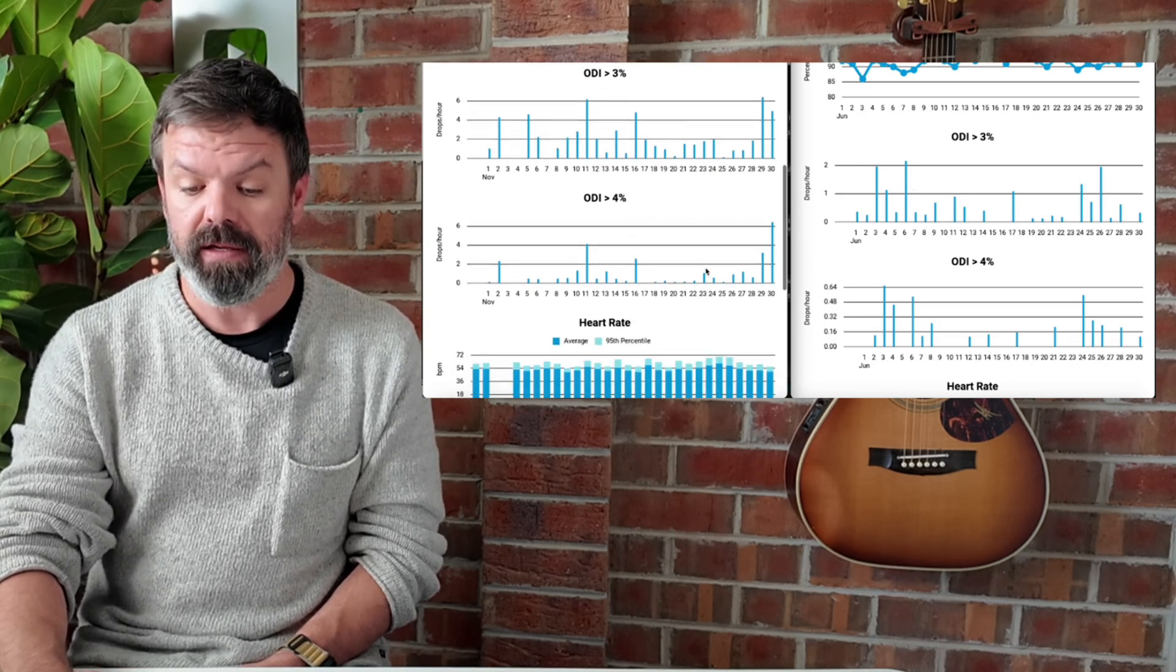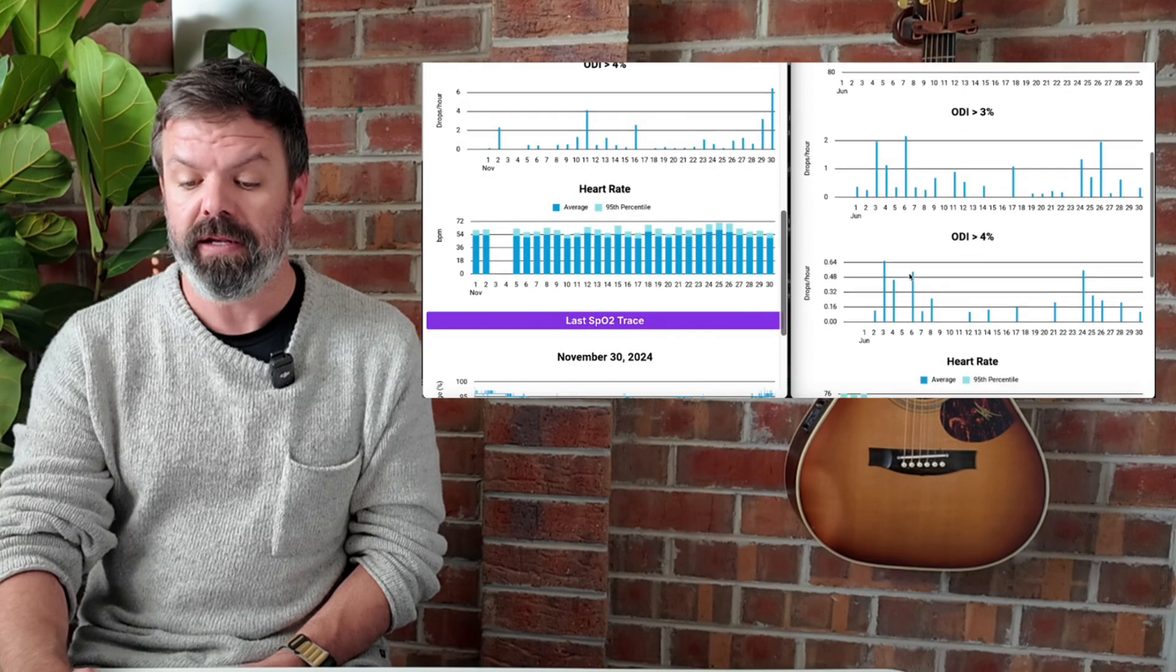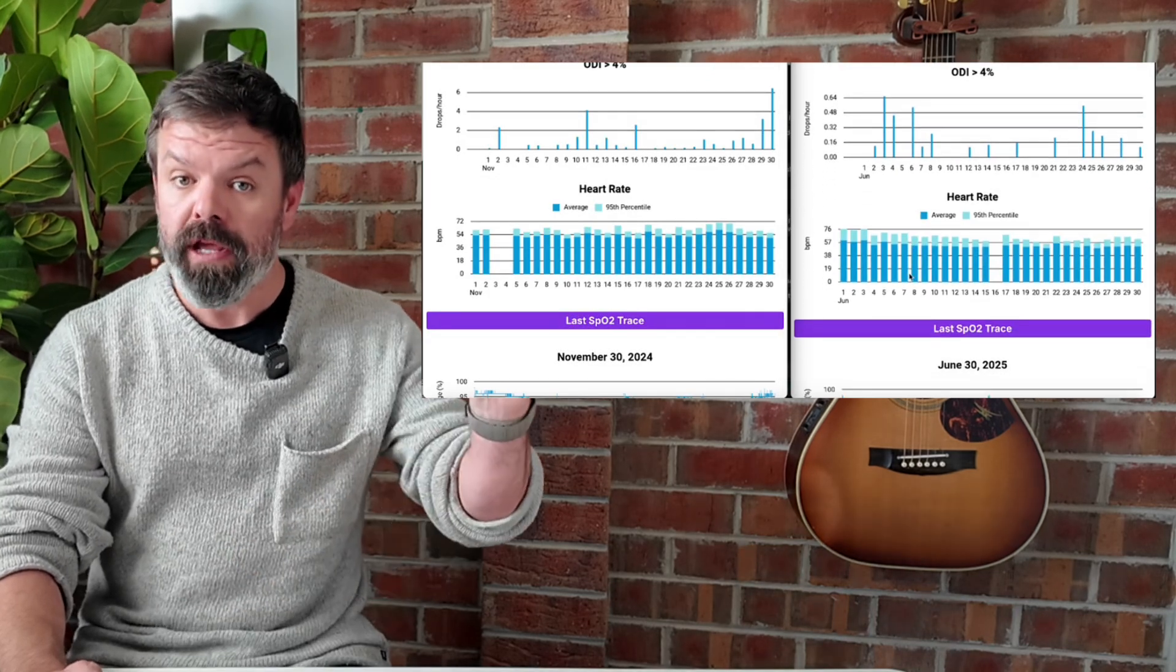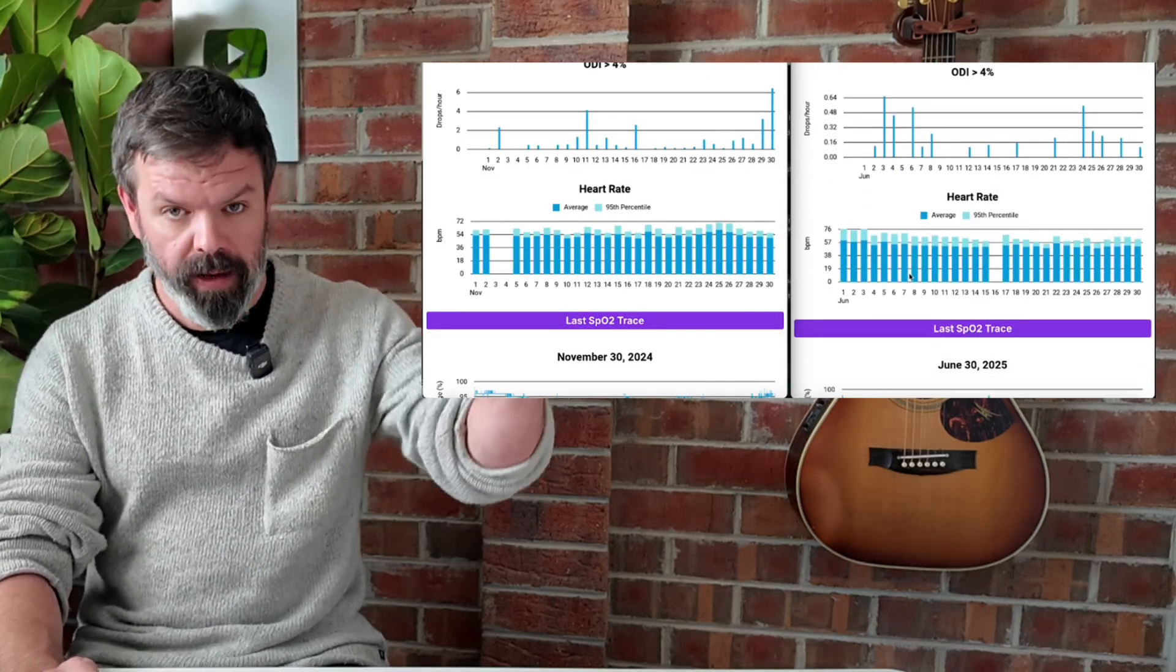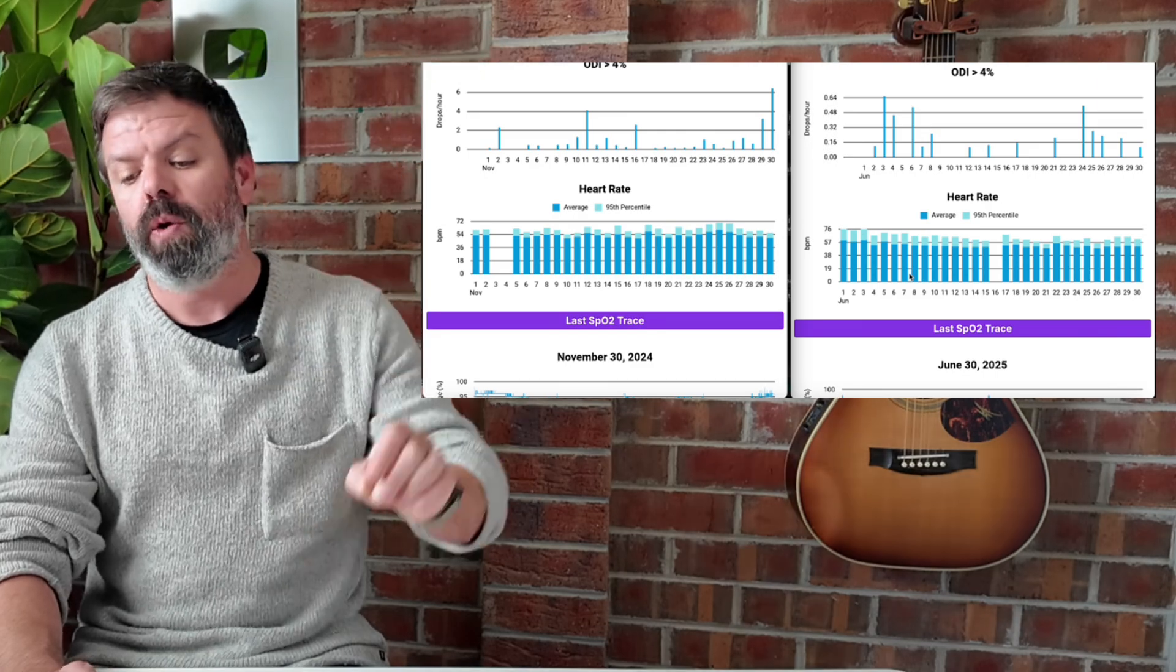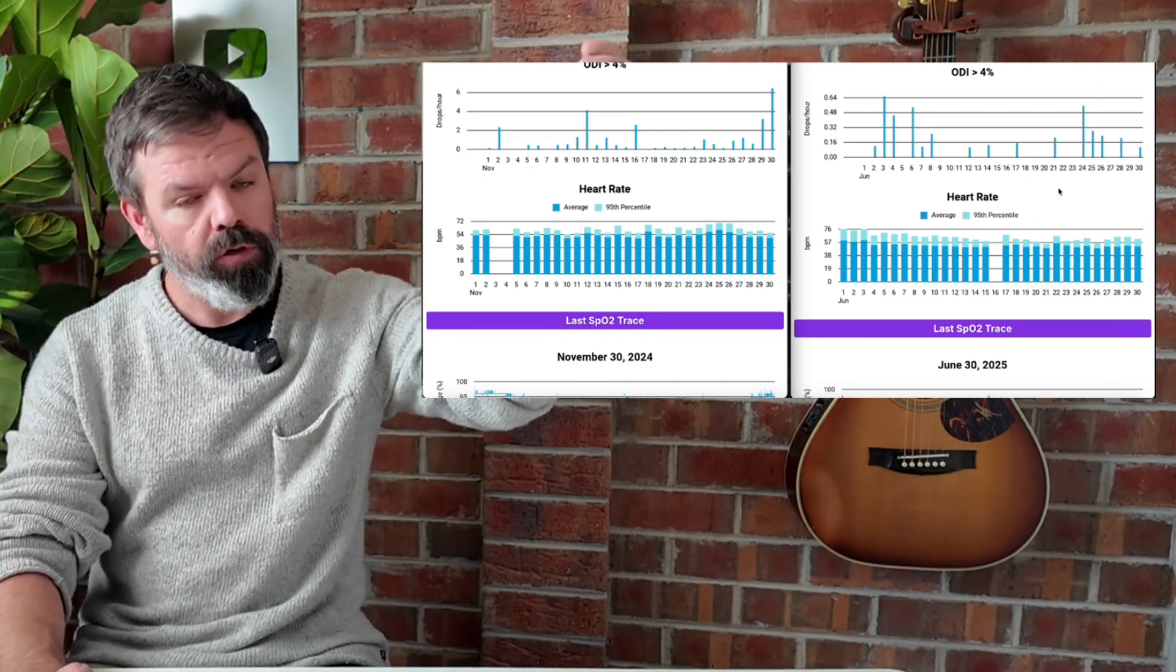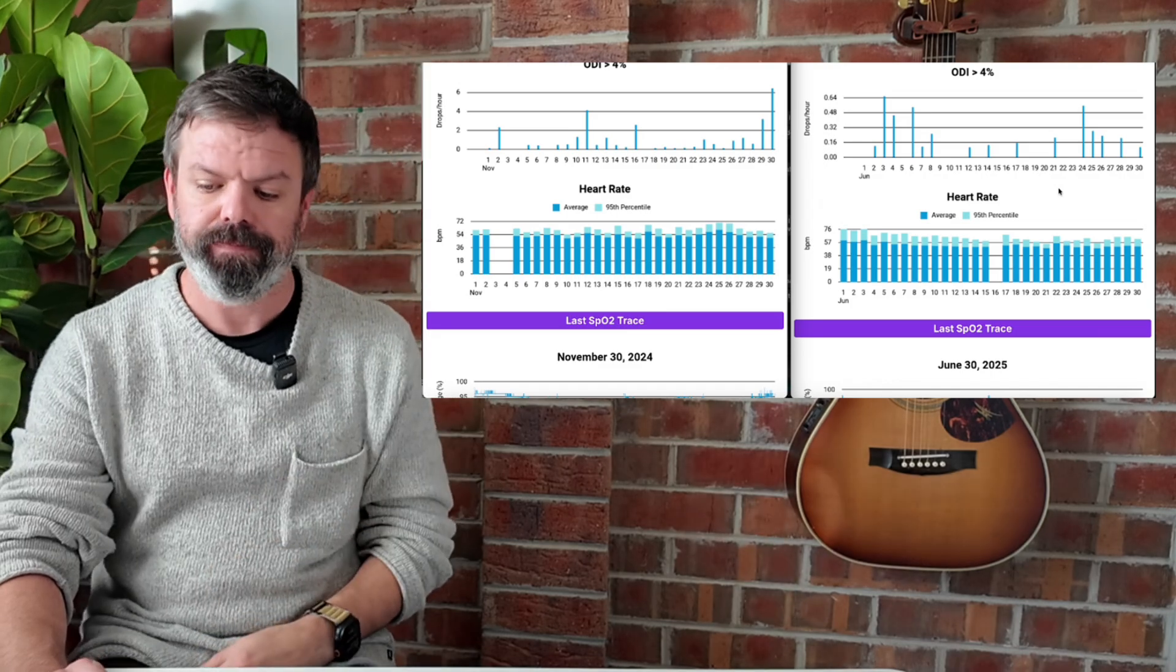And the same thing for the ODI four percent. But instead of using three percent as the threshold down from baseline, back up again, we've got four percent. So it's got to drop further.